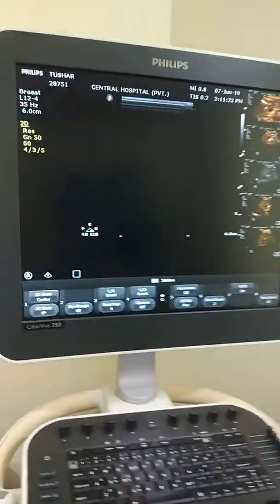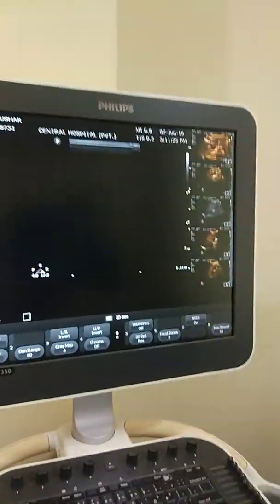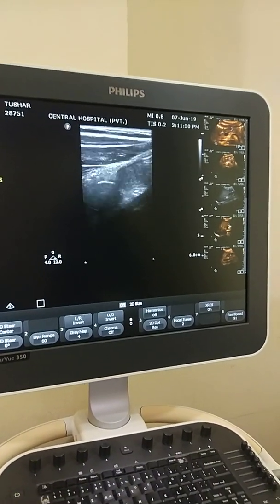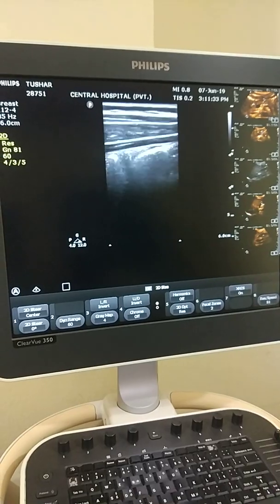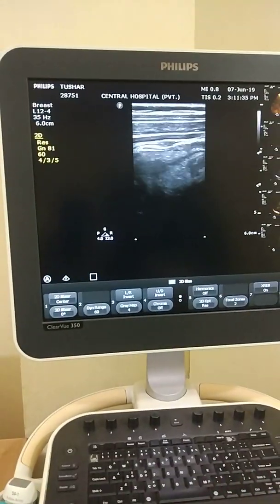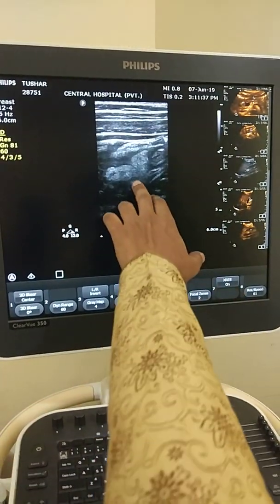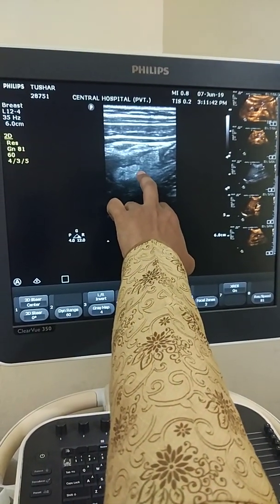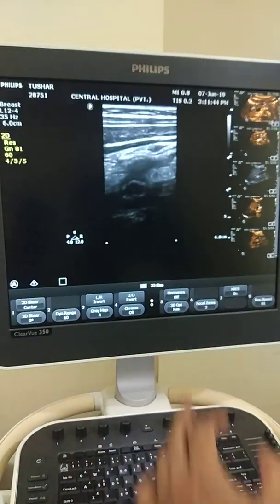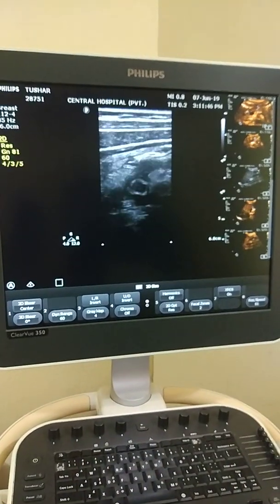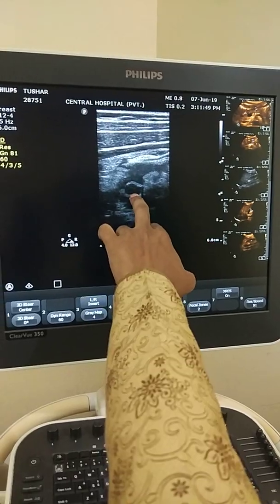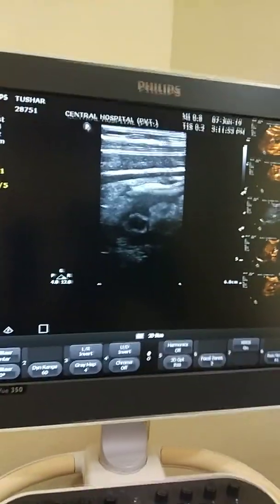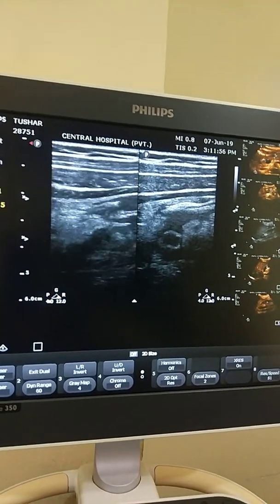When I was scanning the right iliac fossa, it appeared quite normal. Moving to the upper part, I saw some increased echogenicity — some fat. When I saw this fat, I suspected the appendix may be here, and yes, I found the appendix.